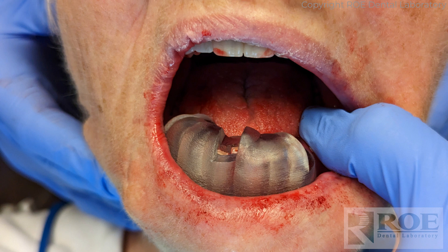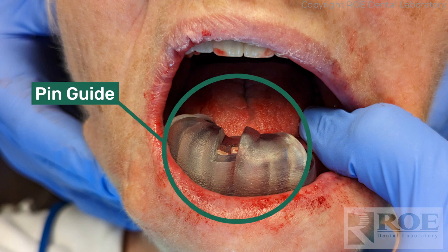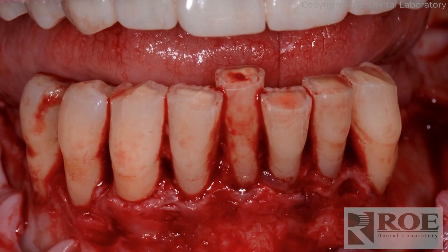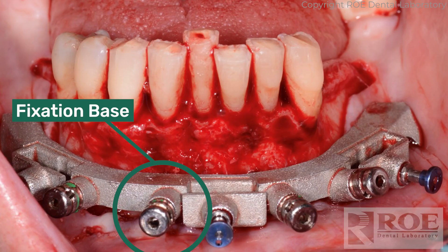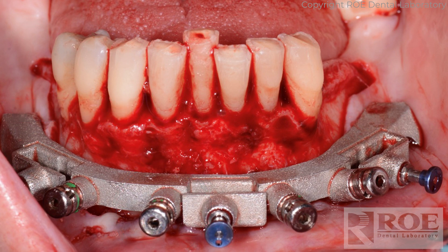With a CombiGuide, as with all Chrome and CombiGuide products, the pin guide — the plastic seating guide — is seated to make sure it fits. There are windows on the occlusal and incisal. Make sure there's no rocking, then remove it. Lay a labial flap all the way down to the level of the fixation base, then deliver the fixation base pinned to the pin guide. Four pins hold the fixation base very firmly during the entire surgery. There's a gap here — this is the floating guide patented technology, which is important for the scanning process later with the carrier guide.